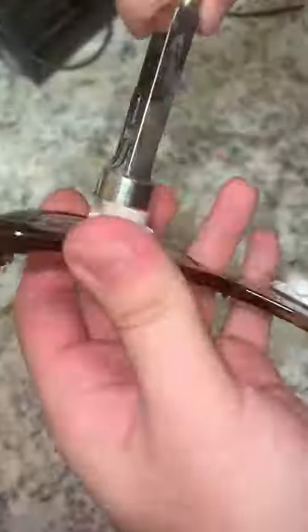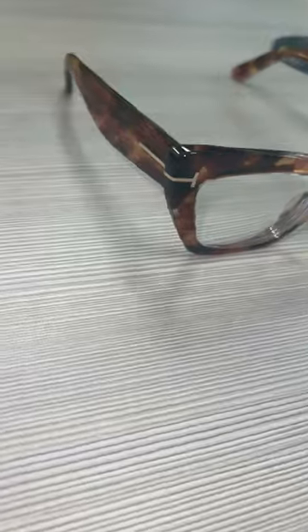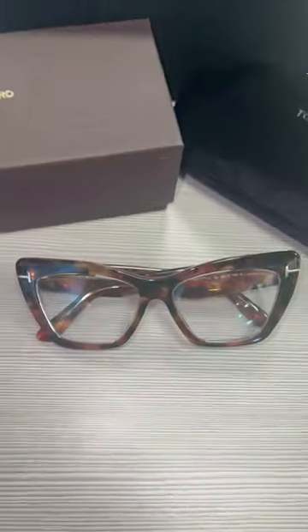The lens comes out all nice and clean. Then the optician wipes off all the water on the lens and fits the lens into the frame.